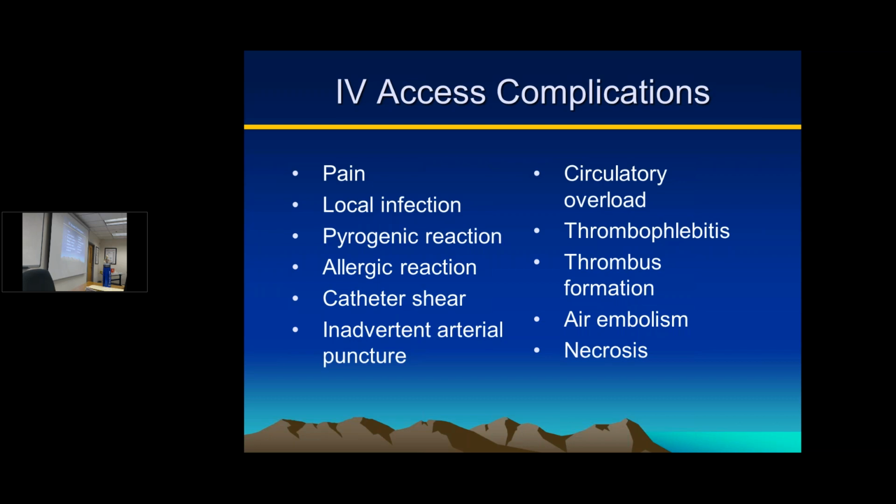It can happen when we go to put it in. It can happen in terms of pulling it back out again. Would you say the most common reason that happens is people going in and out, digging around and pulling their needle in and out? Exactly what it is.